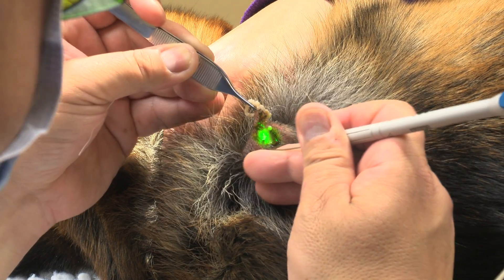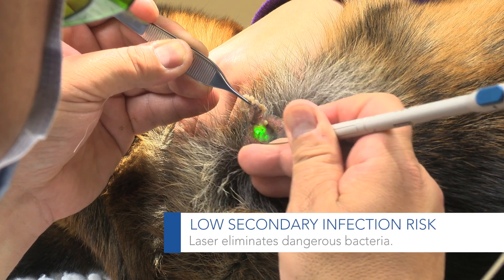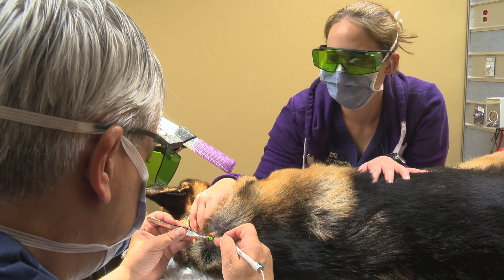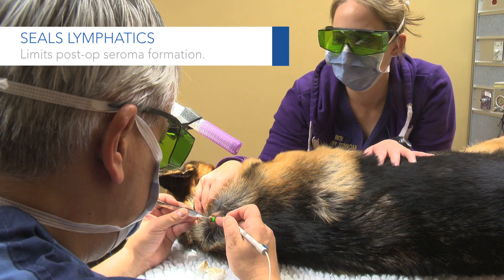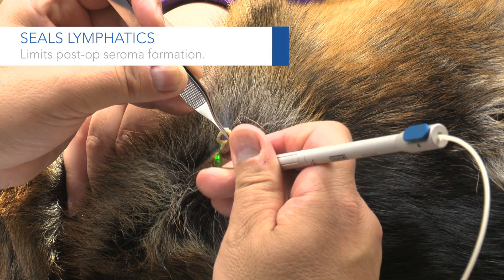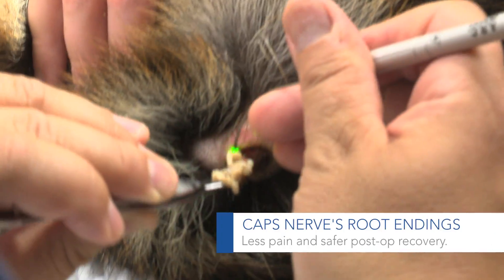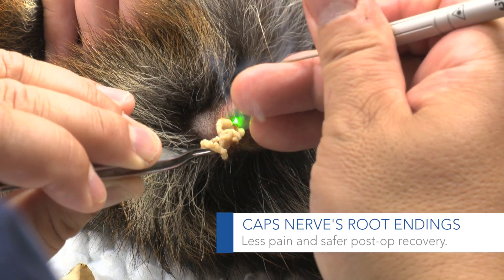The benefit of this is that it will vaporize any germinal cells that are there. It's also cauterizing the lymphatics. Once we get into sub-Q, there's a lot of lymphatics, and that's where we actually start to run into seroma formation. So the benefit of the laser is that it minimizes seroma formation. It caps off blood vessels and nerve root endings, so we don't have a lot of post-op inflammation and pain.